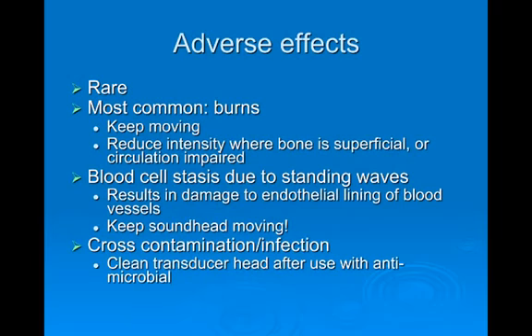So adverse effects. The nice thing is there are not too many adverse effects. The most common thing that's going to happen here is a burn. If you mind proper application technique and keep that sound head moving, you're going to avoid that. If you're not working over insensate areas, someone's going to tell you when it gets hot, so you shouldn't have too much of a problem there. And make sure that you're reducing intensity when you're over superficial bone, or where someone has circulation impairments.